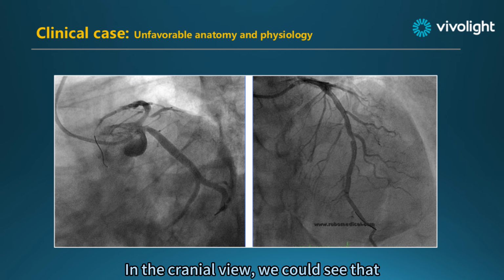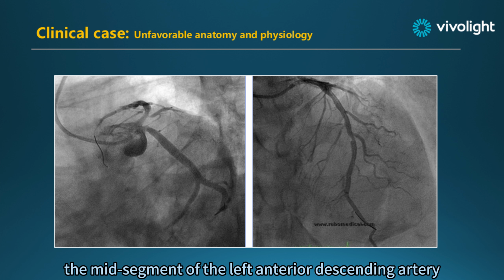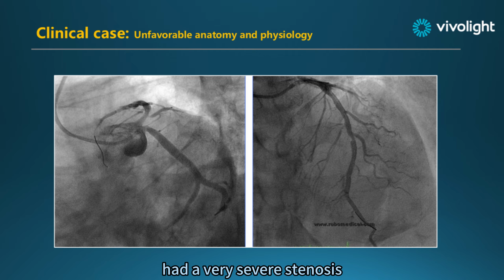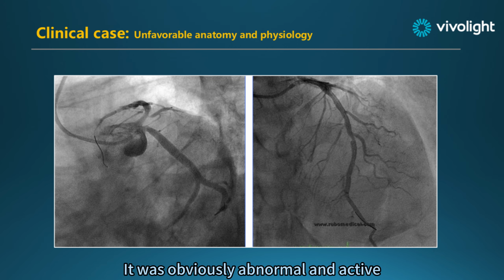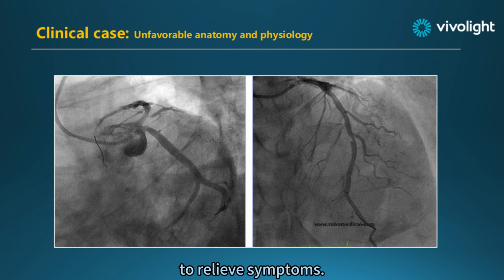In the cranial view, we could see that the mid-segment of the left anterior descending artery had a very severe stenosis. Therefore, from both anatomical and functional perspectives, it was obviously abnormal and active. Interventional therapy was indicated to relieve symptoms.